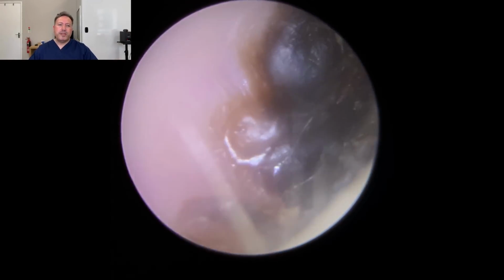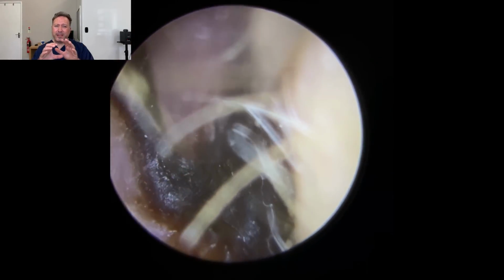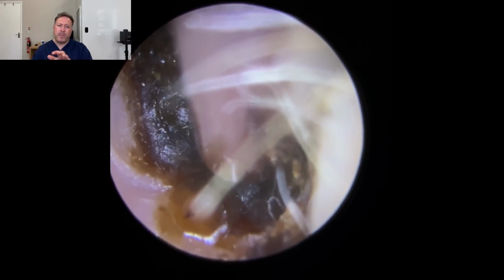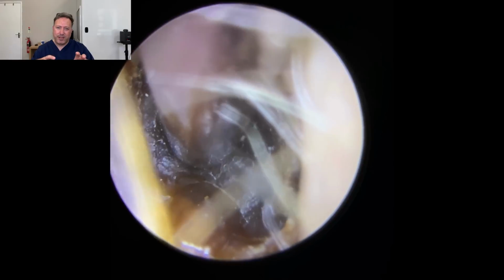So what you can see here, when we look inside this ear, the first thing you'll notice is the wax is very dark, so very old. The second thing you'll notice is that the wax itself has a really deep depression right in the center of it. Now that depression is because this patient has been using Q-tips in their ear canals.